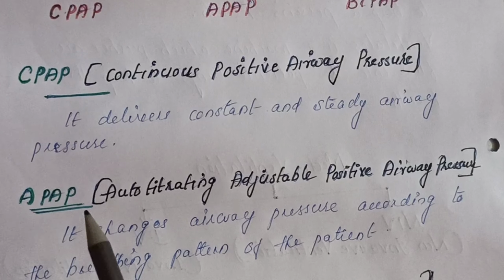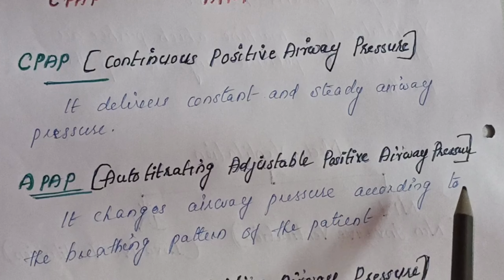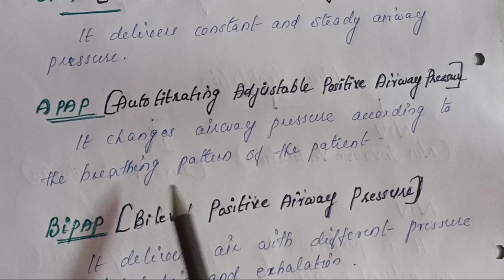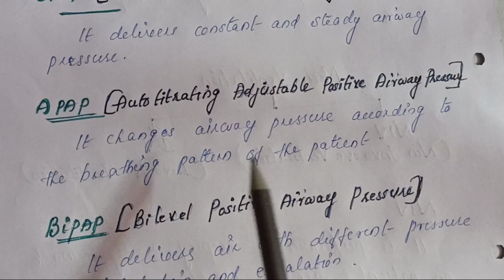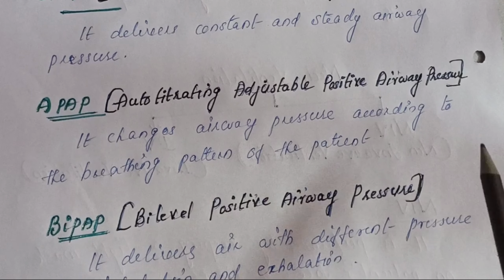Next one is APAP, that is auto-titrating adjustable positive airway pressure. In this, it changes the airway pressure according to the breathing pattern of the patient. So in APAP, the airway pressure will vary according to the breathing pattern of the patient.